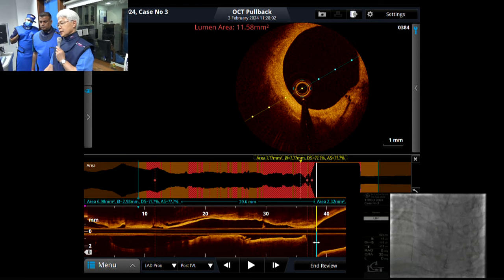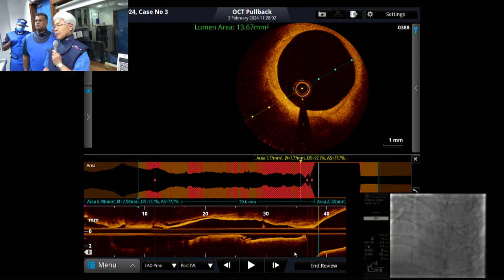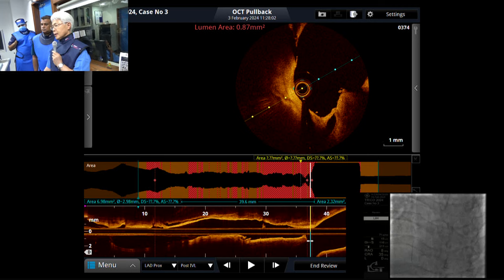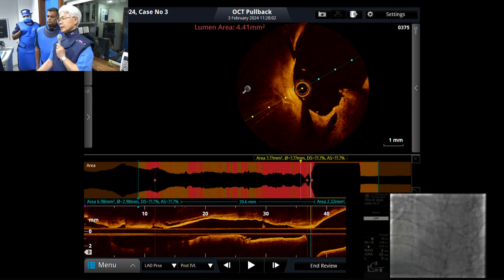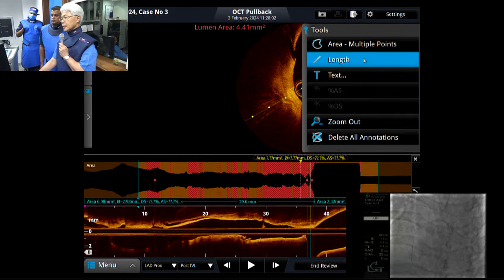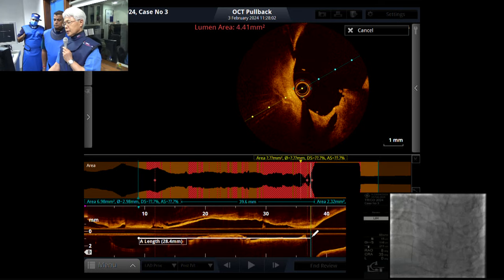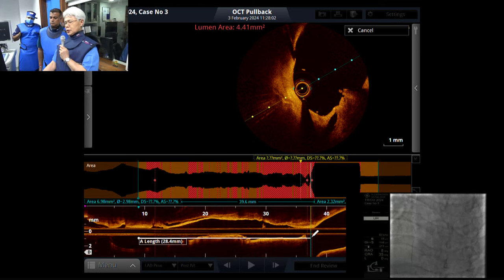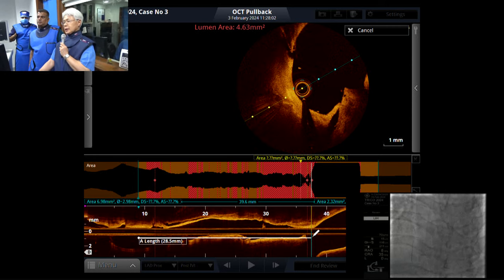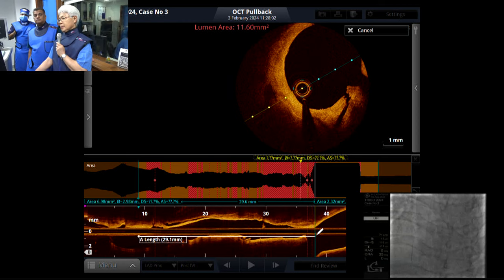So should you be stenting from LAD to left main? No. I will be sparing left main. I will make sure that I cover the ostium of LAD well. May it be 1 millimeter protrusion or something here and there, no problems. I don't want to touch the left main. 28. What is the length? Normal to near normal segment? I think 28. Maybe from here to the bifurcation, right? So 28 is fine. 34 is available in Onyx, 3 by 34.